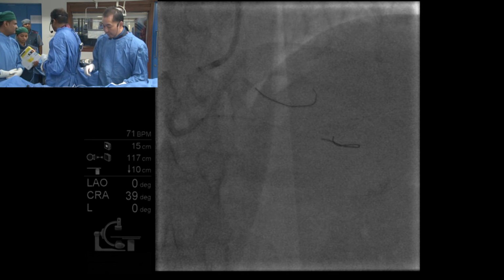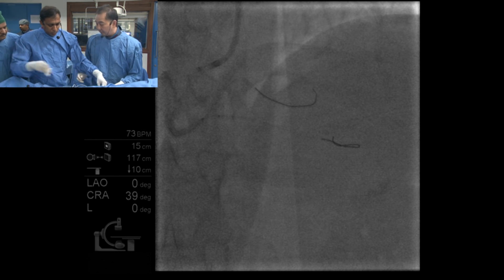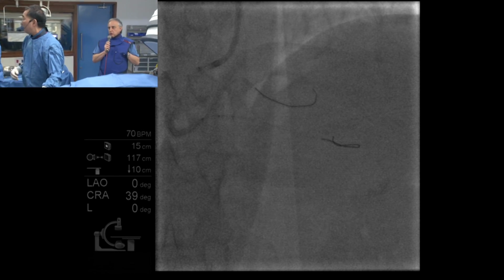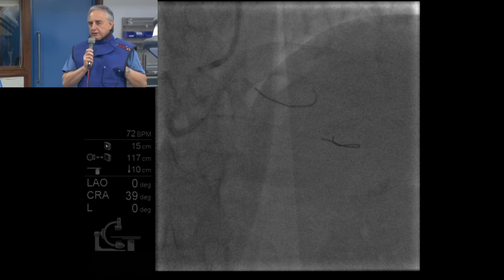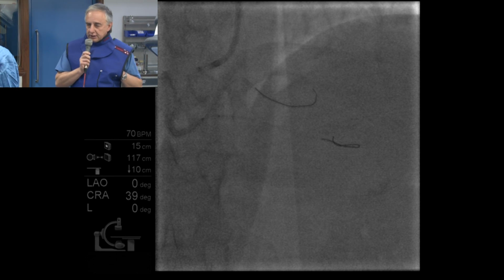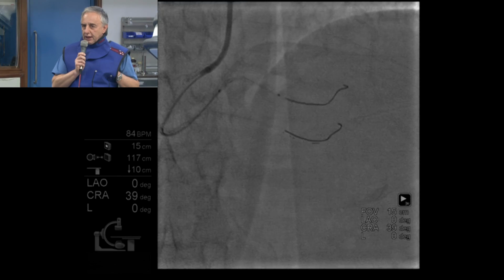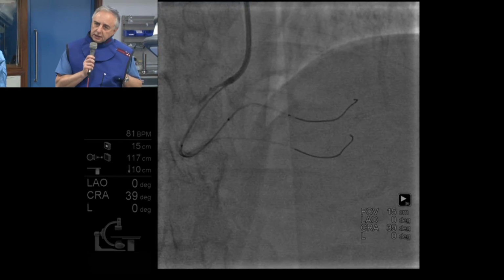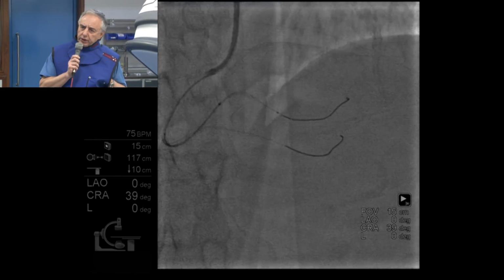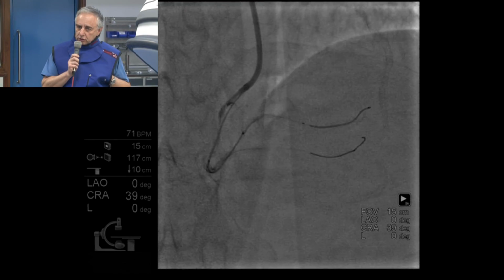3022 is good. 3022. What size balloon do you use for the side branch protection, Tuck? We can't hear Louise. Let's go for the main branch, and then proximal optimization, and then recross later. There are all these variations on these techniques, and I think this is a good alternative that will help in those patients where it is very difficult to reaccess a side branch. This is a very good technique to be able to do that.